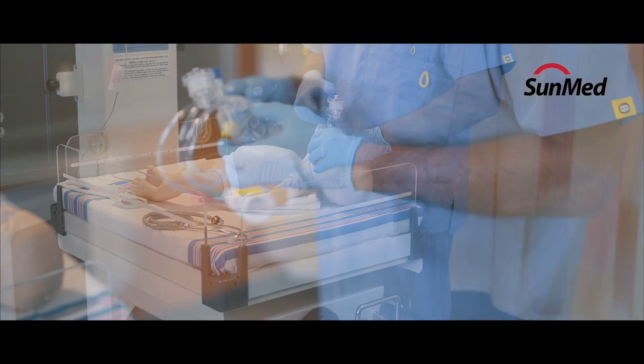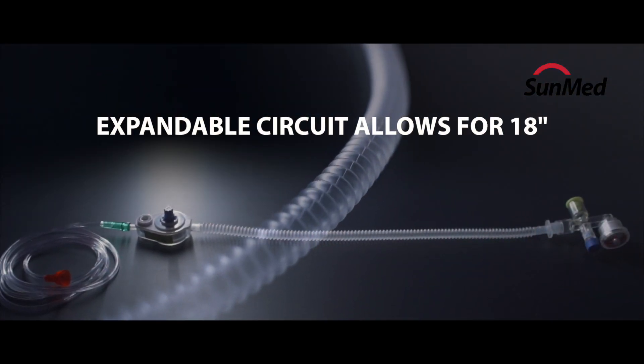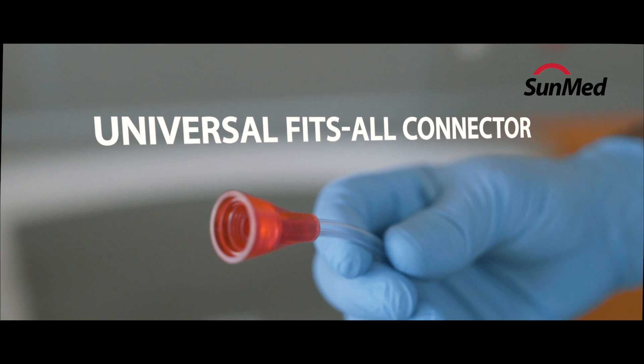This single-unit portable device reduces potential risk which may be caused by clinicians' inconsistent manual pressure delivery.